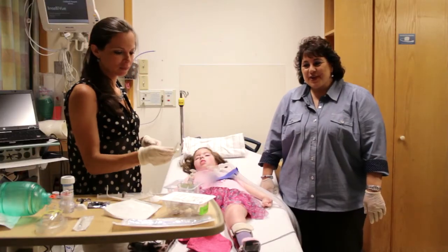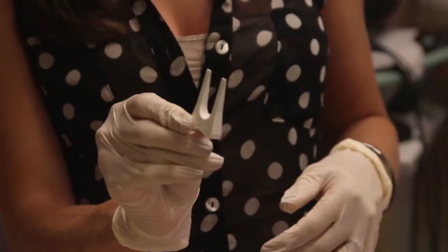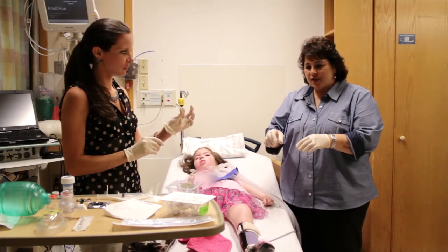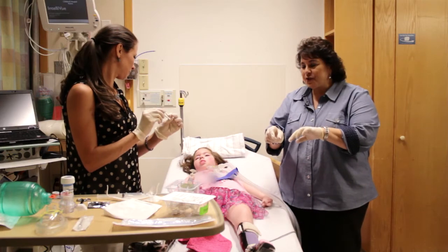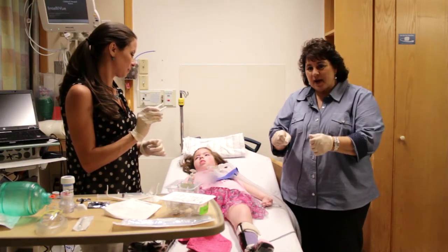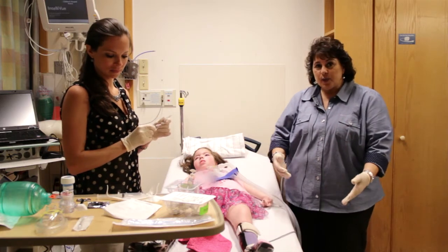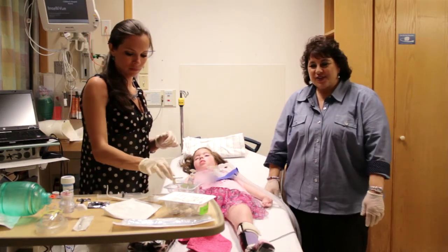Also in the package with the tracheostomy tube comes the wedge, or what I call the tooth, and this is a plastic device that helps detach the tracheostomy tube from the ventilator tubing. If you ever have difficulty getting them apart, you slide the wedge in and it assists you with getting them apart so that you can then hand ventilate or whatever you need to do.